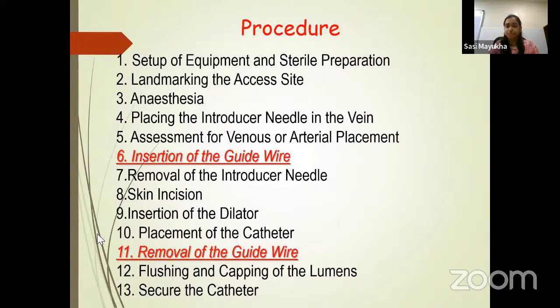The other important step is removal of the guide wire, because there are a lot of incidences where the guide wire has been pushed inside and the patient has been sent to the cath lab to remove the guide wire. There are a lot of complications if the guide wire is left in place.